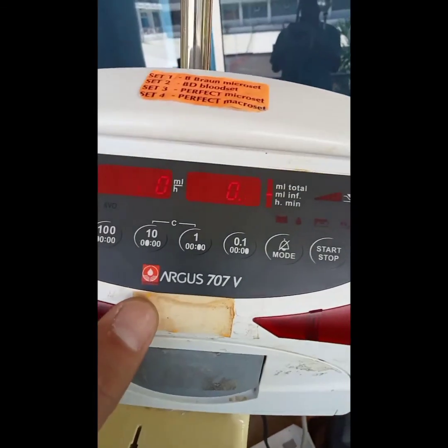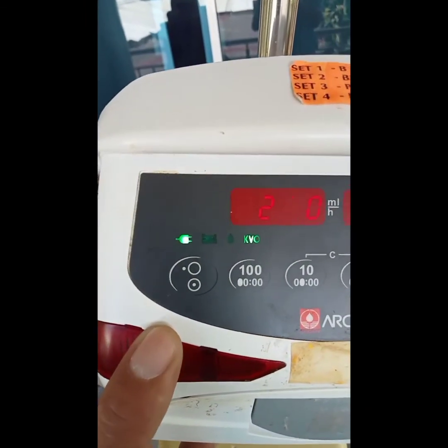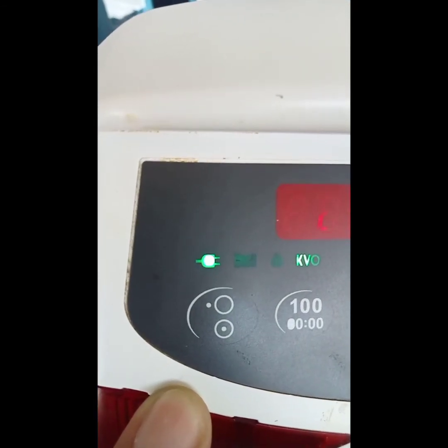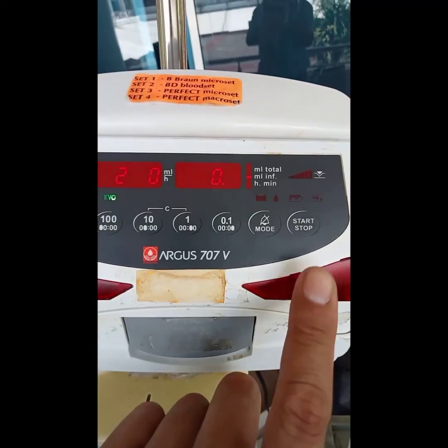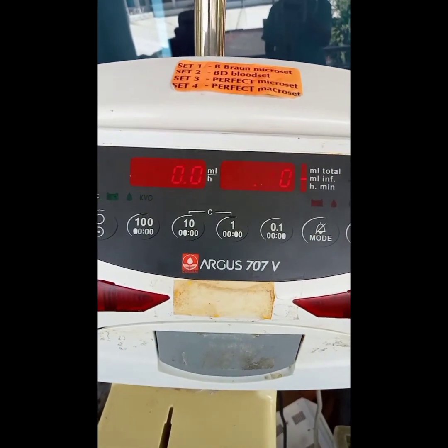Then again, Biomeds, please refer to a service engineer if in case you don't know what you're doing, because this is a critical equipment, needs calibration every time it is being fixed or repaired.